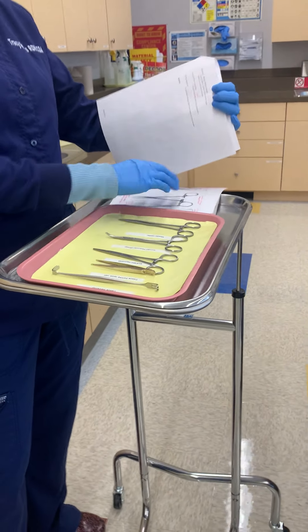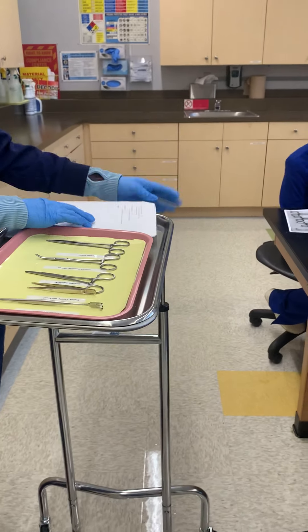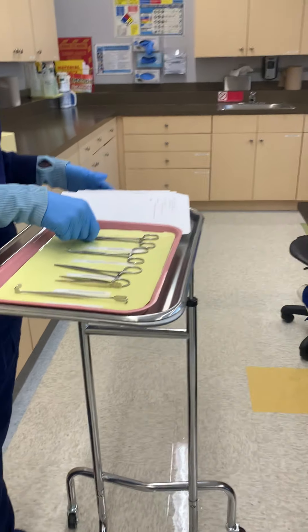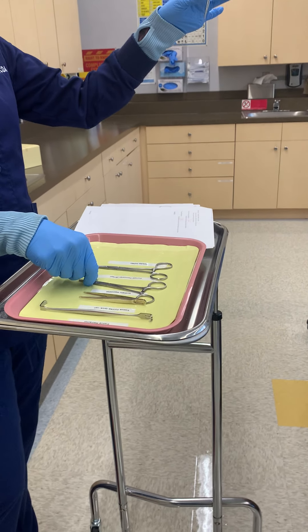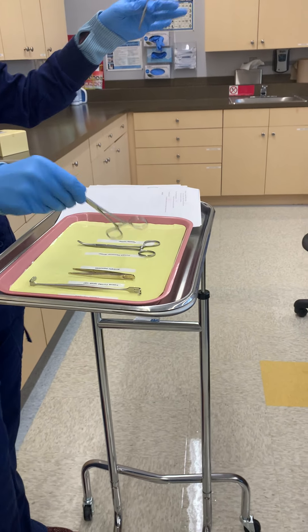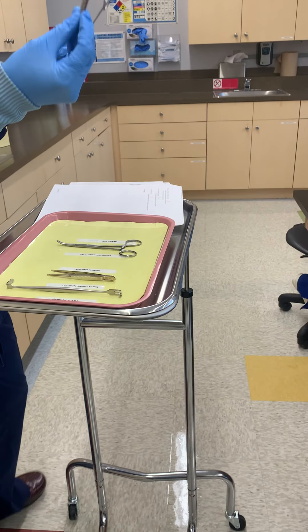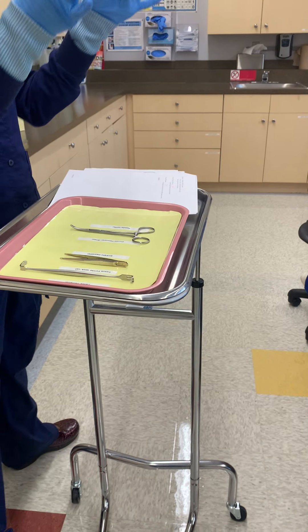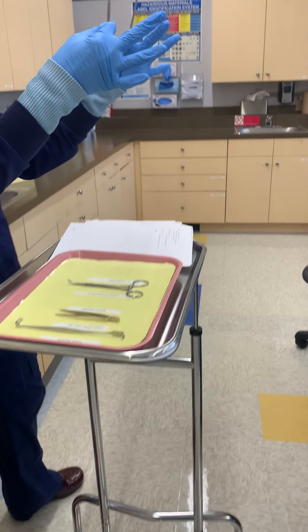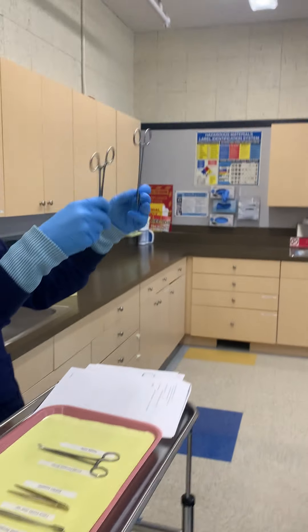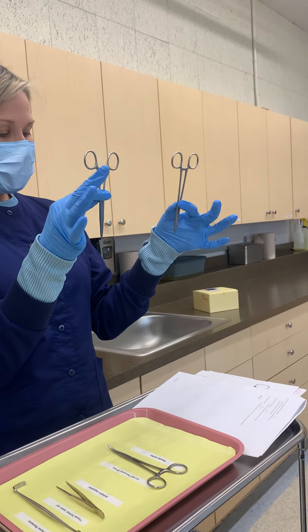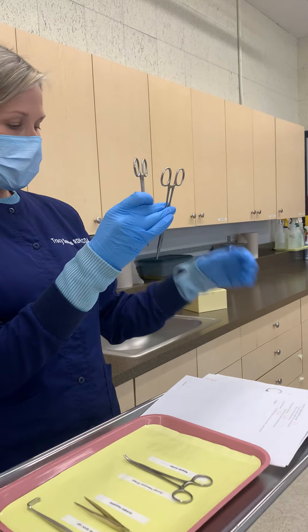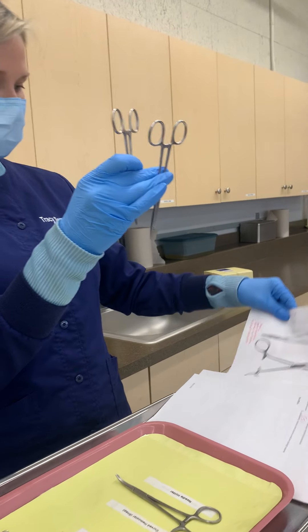The one that we skipped over is the needle holder. This is the needle holder, and this is your straight hemostat. They kind of look exactly alike, so you're going to want to make some notes.